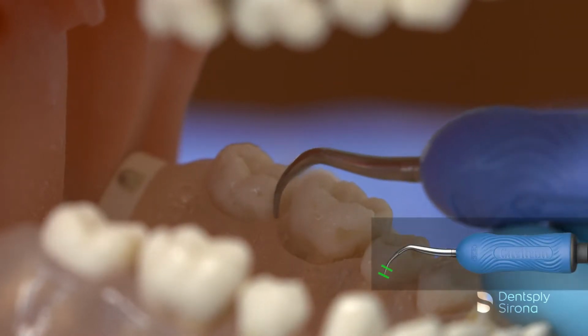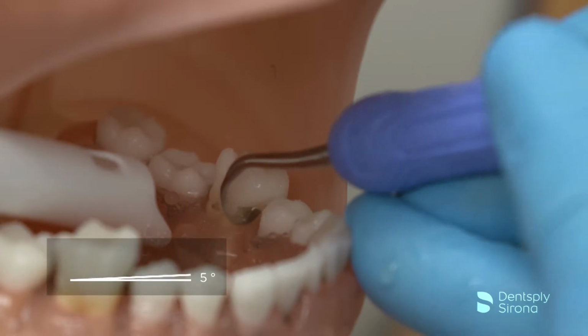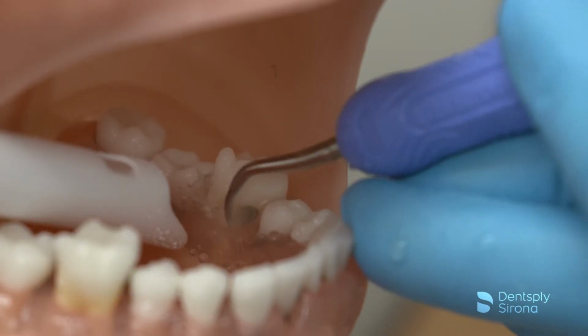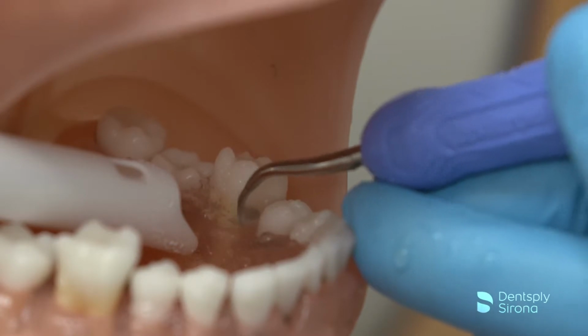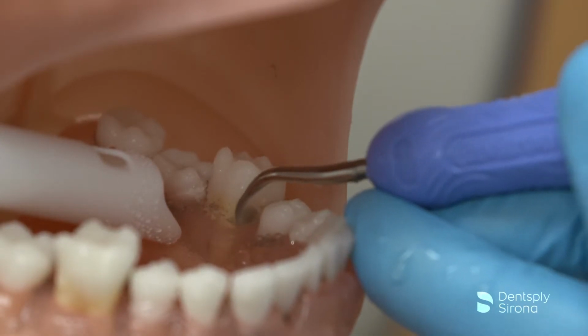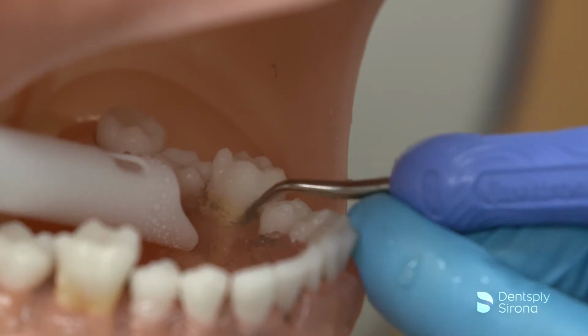Utilizing a transverse orientation, maintaining 2 to 3 millimeters of adaptation and 0 to 15 degrees angulation, the clinician utilizes strokes in the horizontal, transverse, and vertical orientation to microfracture and pulverize the deposits. Adaptation of the terminal end is essential for effective removal and protecting the tooth surface. Thorough biofilm removal and calculus is achieved with an overlapping methodical stroke pattern.